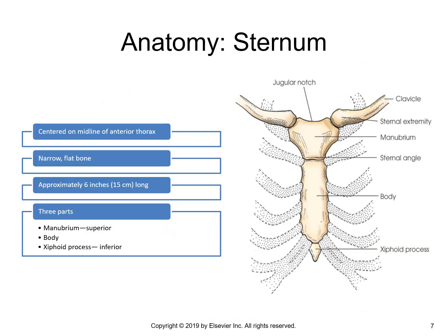So there, now it advanced. All right, sorry, the font's a little small on this one. So here's the parts of our sternum. It is centered to the anterior midline, so you'll find it on the mid-sagittal plane. It will be superimposed on the spine for your straight AP views. That, and the fact that it's a flat bone, makes it very difficult to see. So we don't actually do a straight AP or PA of the sternum. We're going to do a slight oblique to roll the sternum off of superimposition with the spine and the vertebral bodies, and then you can visualize it a little bit better on an X-ray exam.